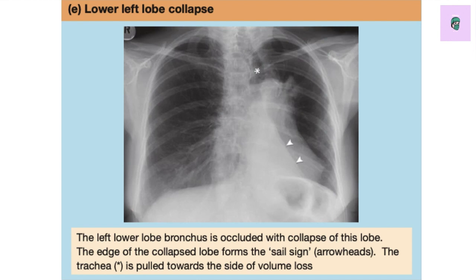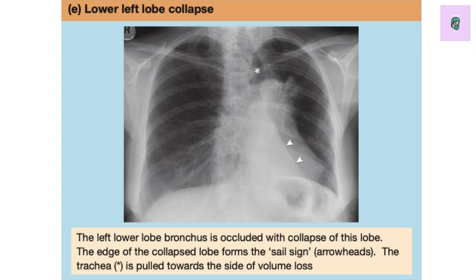Next is lower left lobe collapse. The lower left bronchus is occluded, causing collapse of that lobe. The edge of the collapsed lobe forms the sail sign — it looks like a boat sail, like from Pirates of the Caribbean. Please revise these images again and again because they have a high frequency of appearing in exams. As our teacher used to say, you cannot see what your brain does not know — you have to recognize it in order to identify it, otherwise it will be right in front of you and you won't see it.